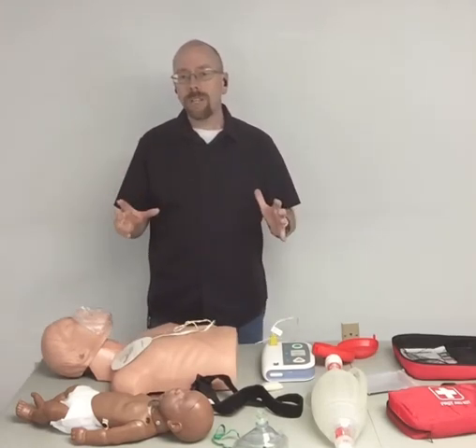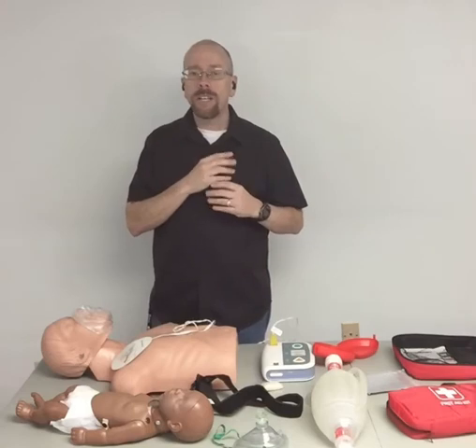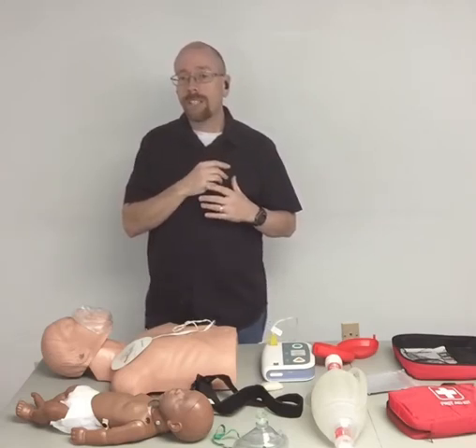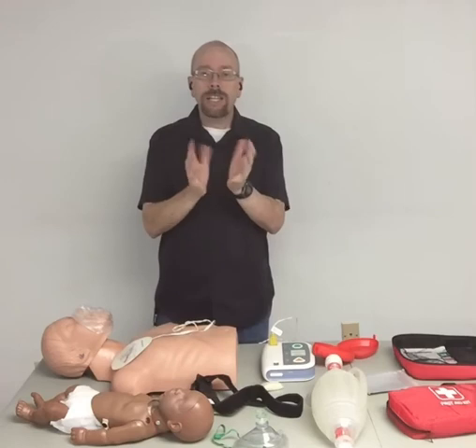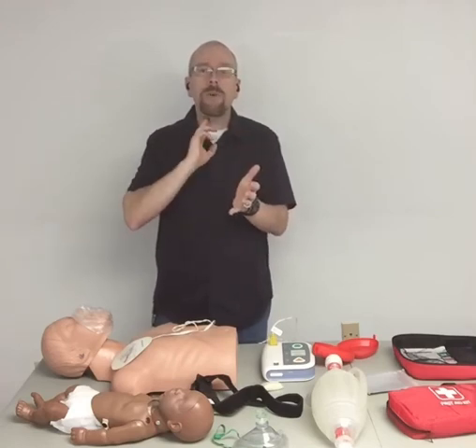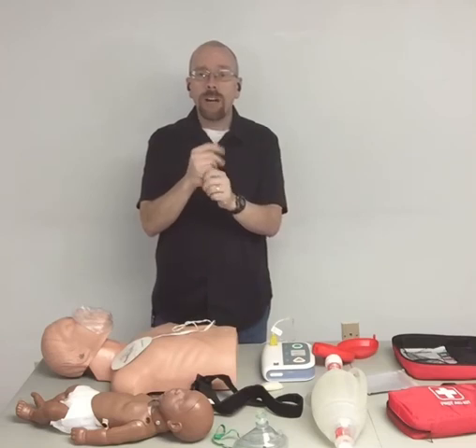But realistically, what's happening is that in our heart, we have a main trigger called the SA node that fires and causes the whole lub-dub process, where it's actually pumping normally. But in this situation where the defib has told us to shock, the heart's just shaking like a bowl of jello. The main trigger to use the defib is that there's no pulse, but actually this electrical activity is still in the heart. It's still doing something, but not enough to circulate the blood like a normal heart rhythm.